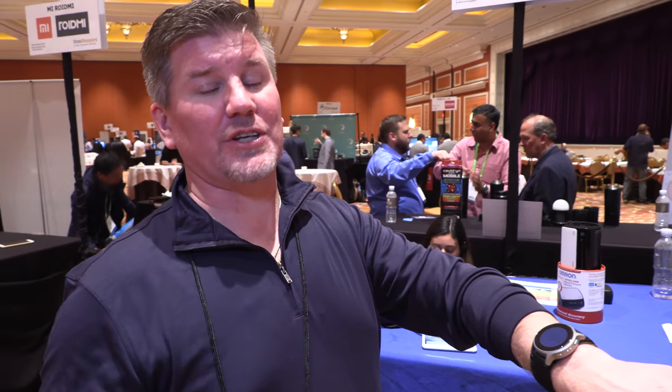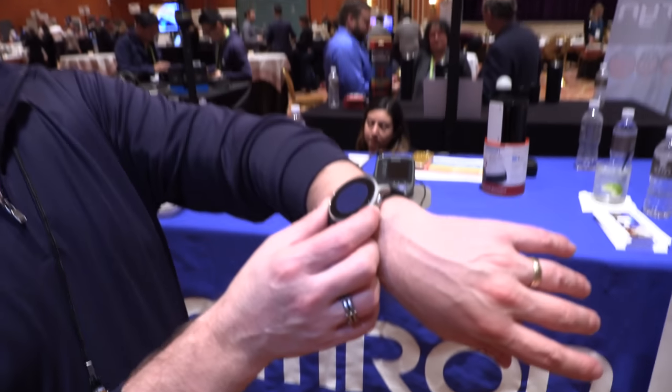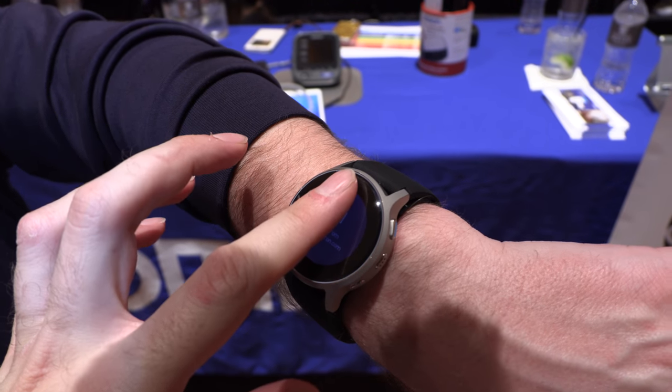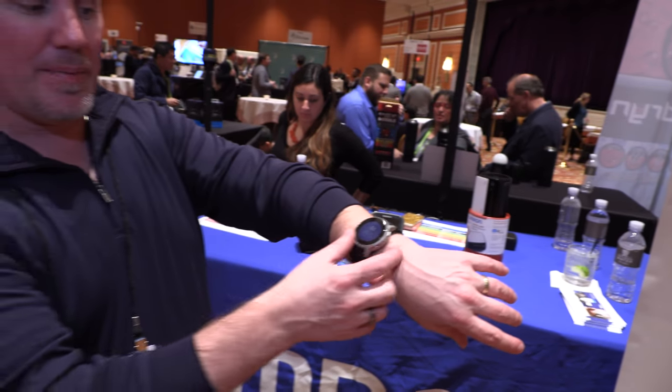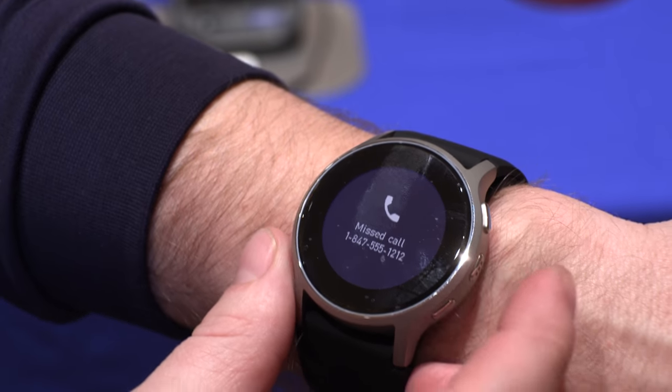It's not running Android or anything like that. The operating system is a proprietary system that Omron created — we want to protect the intellectual property that goes into developing something like this, so we built our own OS. We're compatible with and will be sharing data with both iOS and Android, but we don't utilize their system to run our HeartGuide app. And there are notifications — look how strong the vibration is. You can feel messages, emails, texts, and incoming calls. Notifications are on there as well.